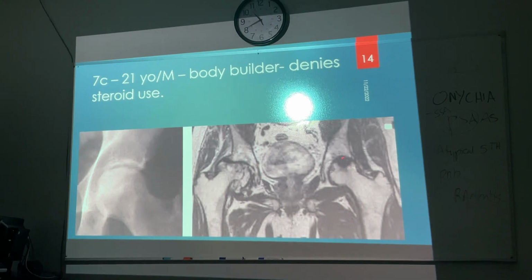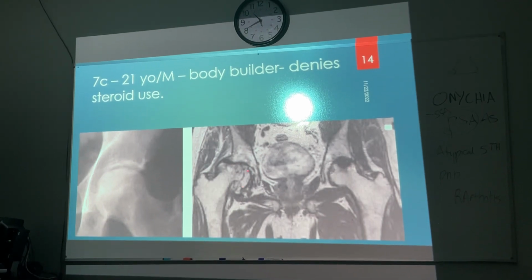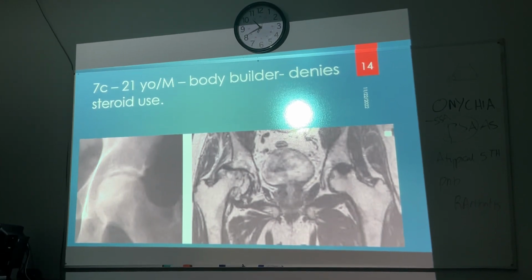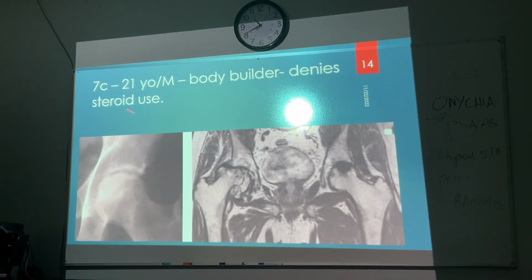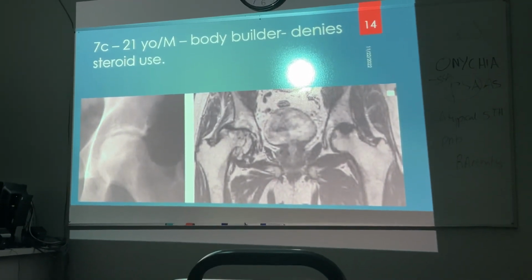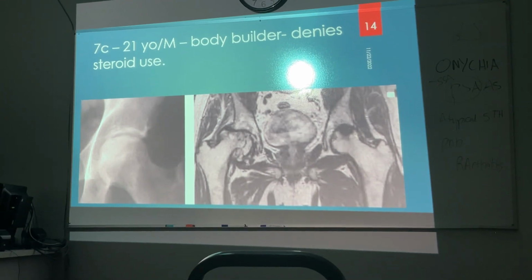And I don't know what this is, but this is misshapen, okay? So the takeaway here is very little to see in the early stages of osteonecrosis. 4 to 6 weeks later in the history of trauma, or this scenario, I want an MRI. MRI is a lot more specific for osteonecrosis, okay?